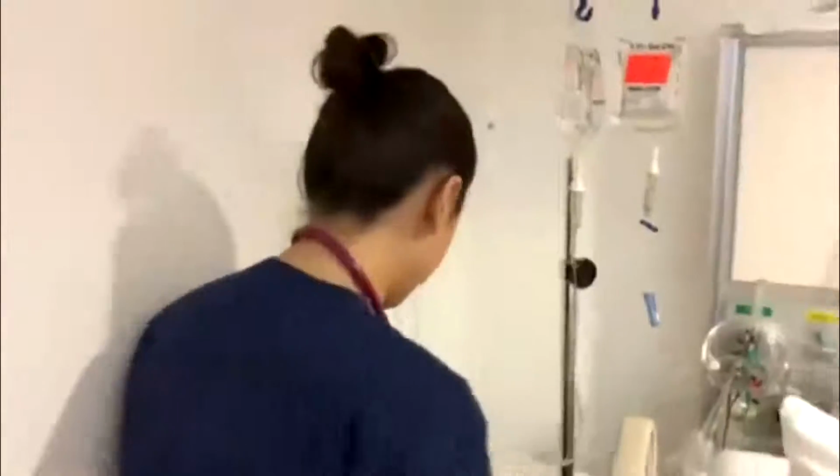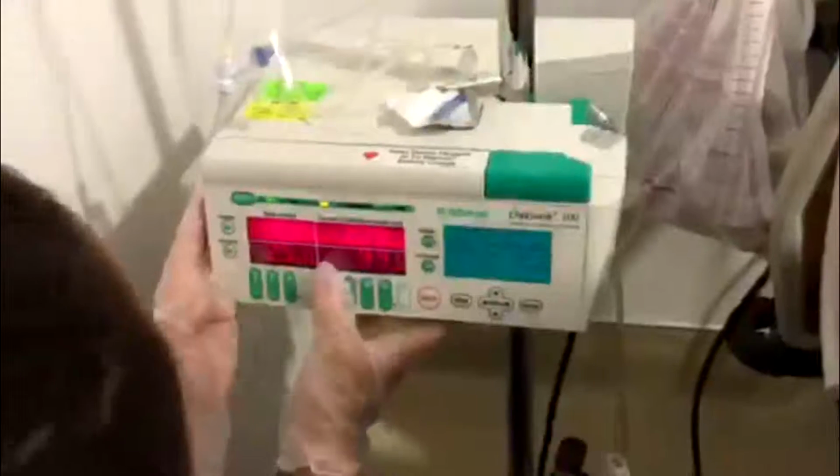So now I'm going to enter my values on the machine. I'll be infusing Zosyn at 25 milliliters per hour of a volume of 100. And again, we want this to infuse slowly, so 75 milliliters per hour for the normal saline, and 25 milliliters per hour with a solution of 100 for Zosyn.